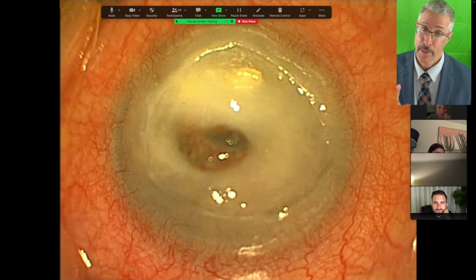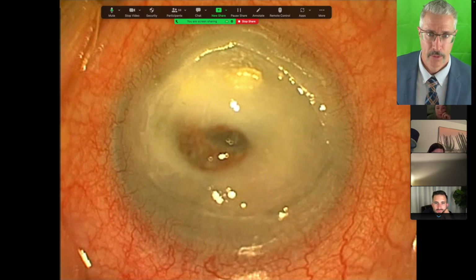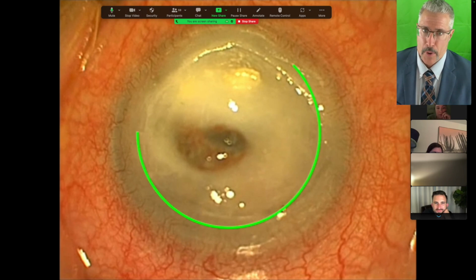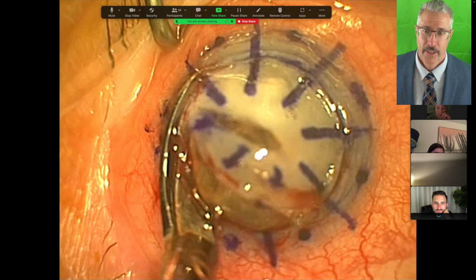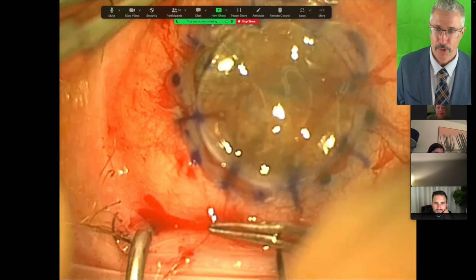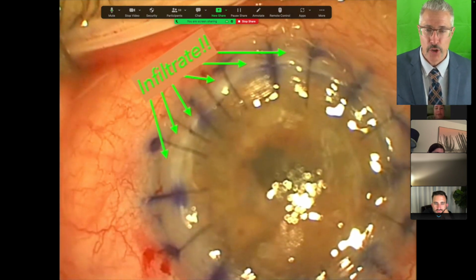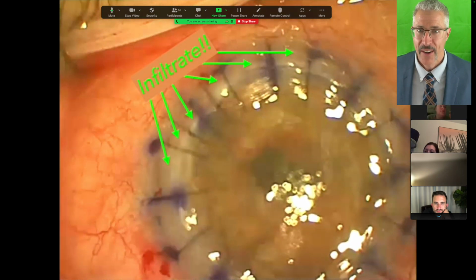I'll tell you what, the people who cherry pick LASIK and cataracts would never take something like this on for one of your patients. But basically, the largest hospital trephine could not cut away the infection. So we go all the way around. The lighting's not the best, but trust me, after I sew this donor in, it's white with infection on this whole rim. So what are we gonna do?